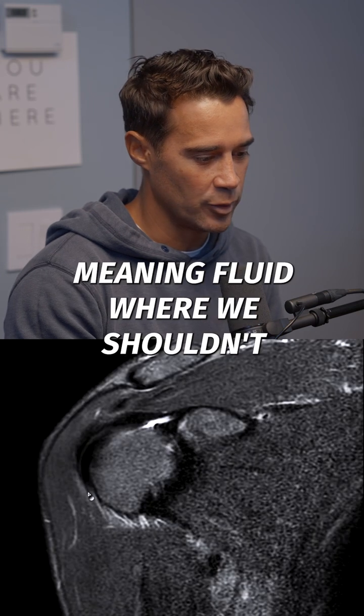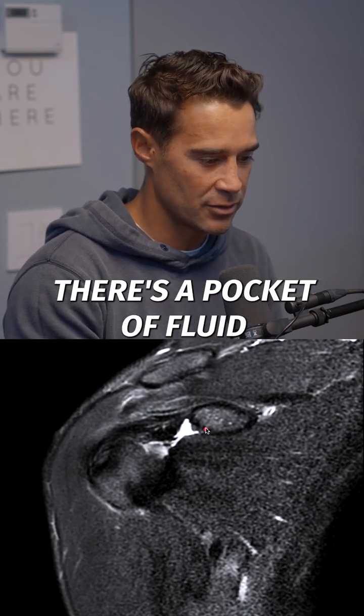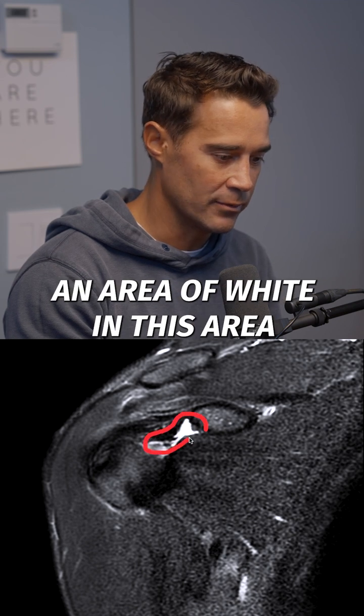As we scroll back and forth, what we want to look for is white meaning fluid where we shouldn't see it. As I go to the very front of the shoulder, you can see there's a pocket of fluid — an area of white — into this area.